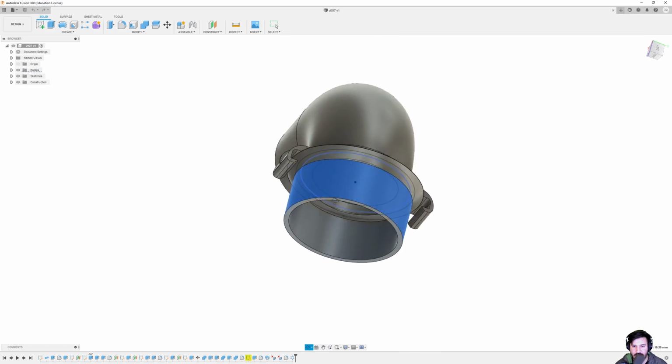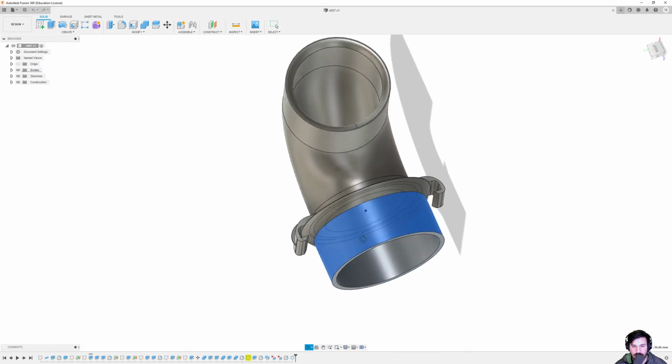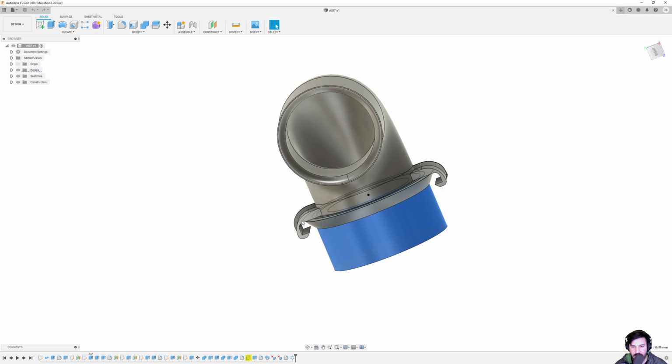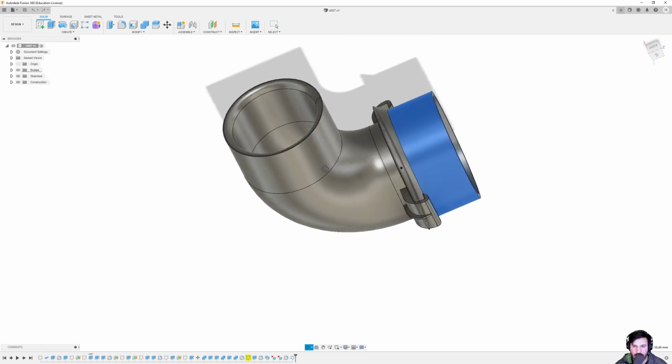And we were able to print on an industrial machine that has supports that you put in a bath and they will melt the supports away. So we didn't have to break the supports off, which means you can design it in such a way where the supports, if you needed to, could be inside of it or in this area here, and you wouldn't have to get in there and clean it out very carefully. This bath would do it.